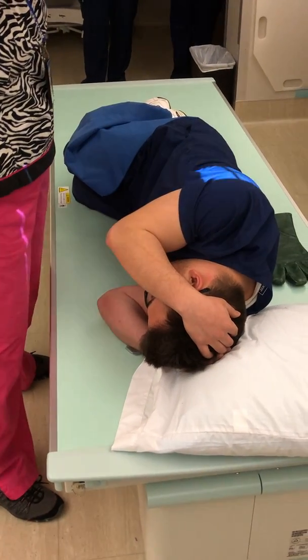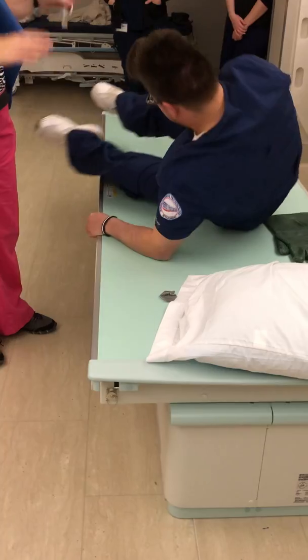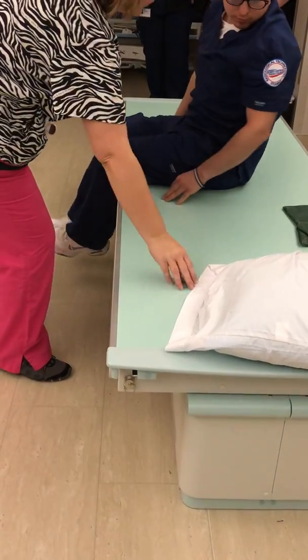Move the tube out of the way. All right, you can go ahead and sit up. Sit for a second to make sure you're not dizzy before you stand up.